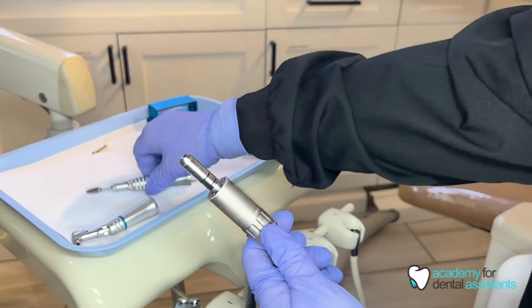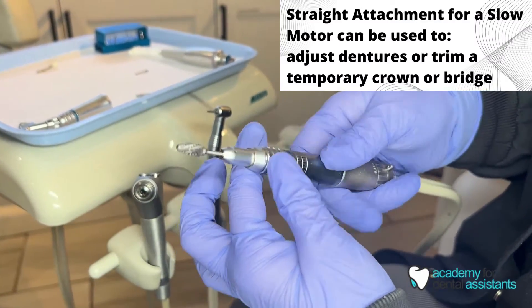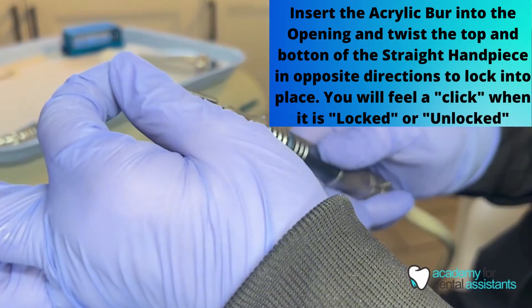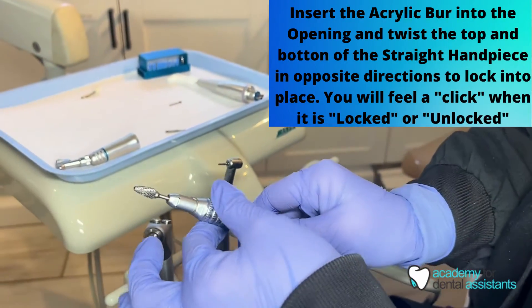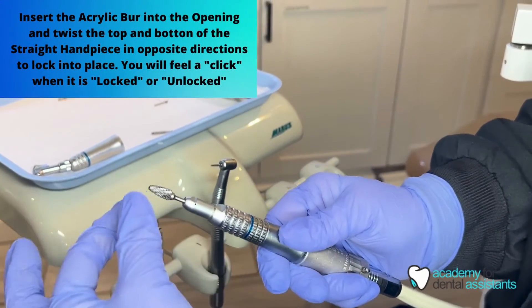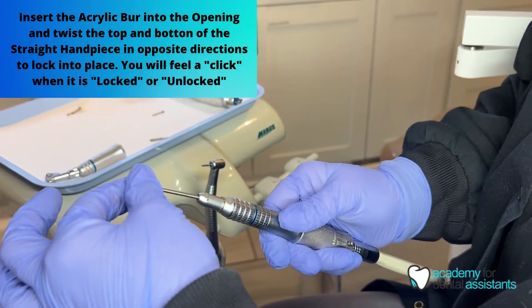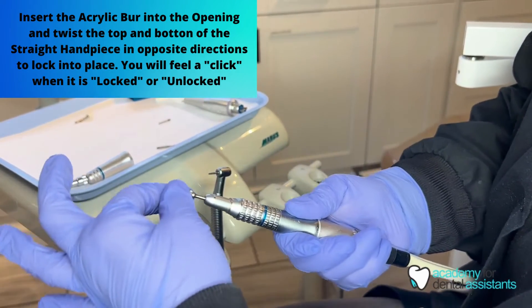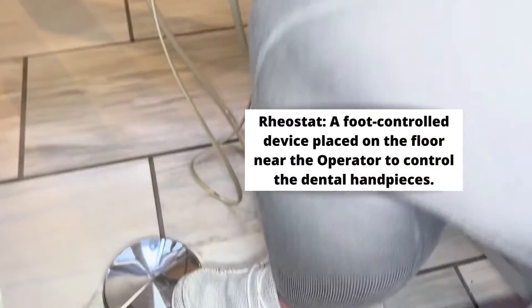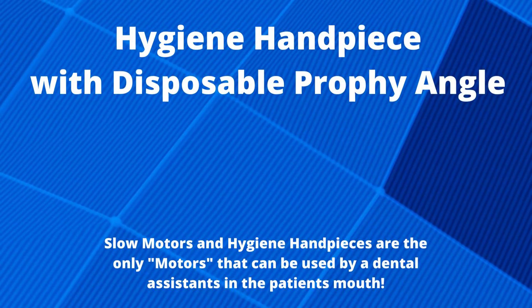The straight attachment is typically used with an acrylic burr or some type of polishing burr. To insert a burr into the straight attachment, you turn the top and bottom of the middle of the straight attachment in opposite directions — counterclockwise to lock and unlock. Press the top one direction and the bottom the other direction; you will hear a click and it's unlocked. You can then take out or insert your burr, lock it, and always press the rheostat pedal on the floor after inserting a burr to make sure it is locked in place.